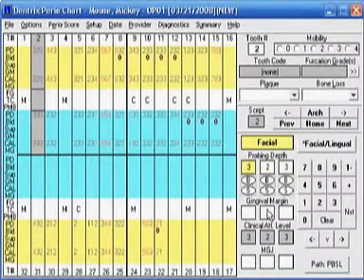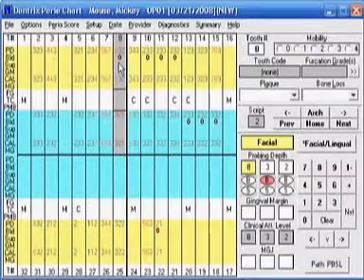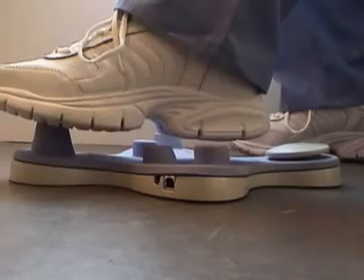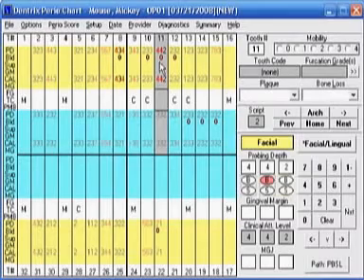I want to show you a fast and easy way to update a perio chart. When you open the program, the latest perio chart will come up. Instead of inputting every number every single time, you can just change the pockets on the teeth that have changed. So let's say the pockets on teeth two through seven have remained the same, but number eight is now a 4-3-4 — take your mouse over to number eight, rock back with your heel, and enter the new numbers 4-3-4. Let's say nine and ten are the same, but number eleven is now a 4-4-2 — go to eleven, rock back with your heel, and go 4-4-2. Do this throughout the mouth and by just changing a few teeth, you've updated the whole perio chart.